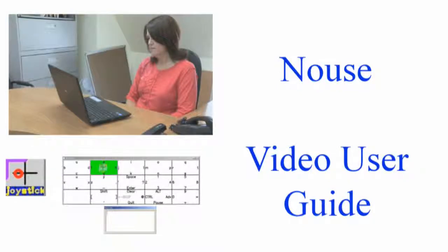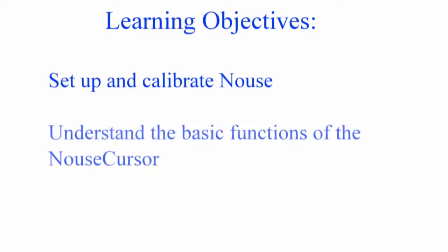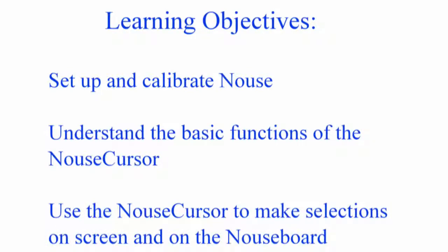Welcome to this training video on how to use Nouse. During this video you will learn how to set up and calibrate Nouse, understand the basic functions of the Nouse cursor, and use the Nouse cursor to make selections on screen and on the Nouse board.